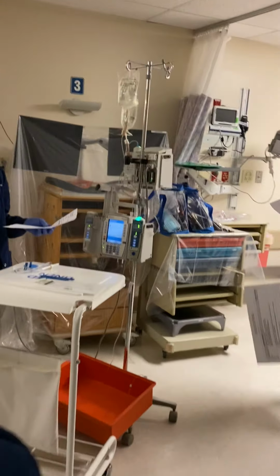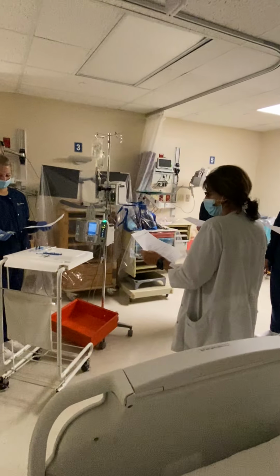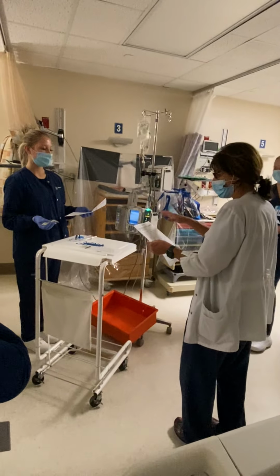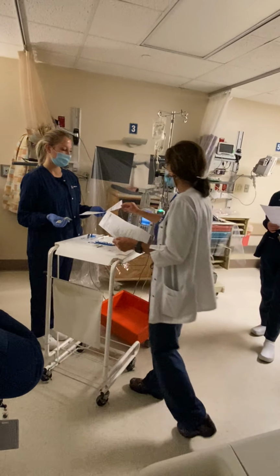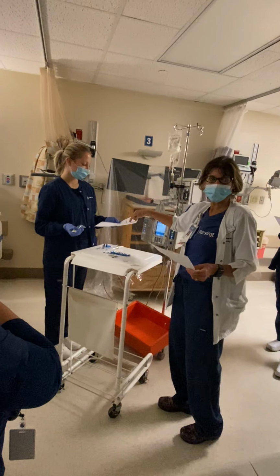If you realize you forgot and you've already hung the medication, then we have to dock you the whole area, because that's all or nothing. Okay. So, no, good. This is why you practice, so you make sure. And again, if you have your MAR, just remember, look at everything that's on your MAR. Your allergies is staring you right in the face.